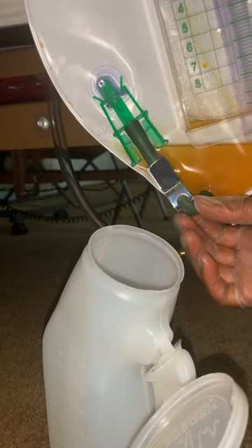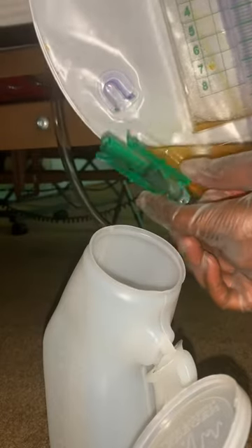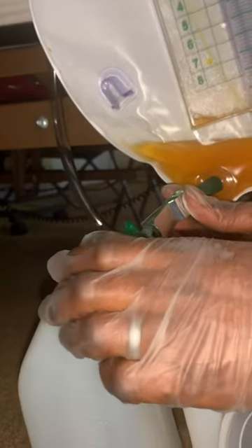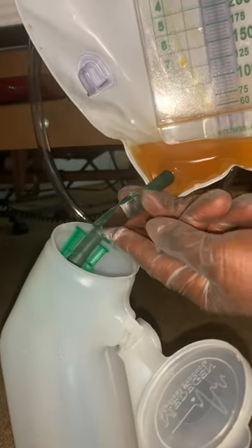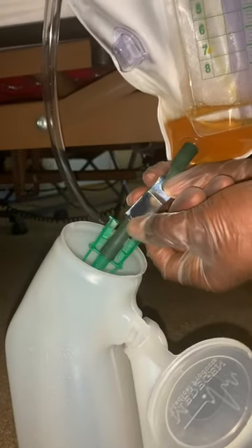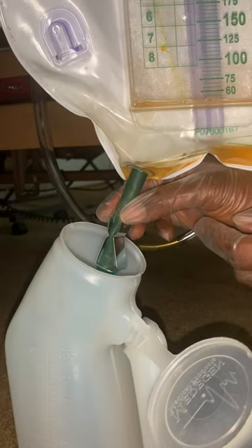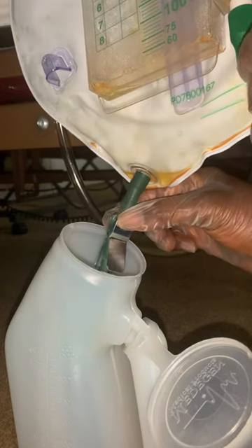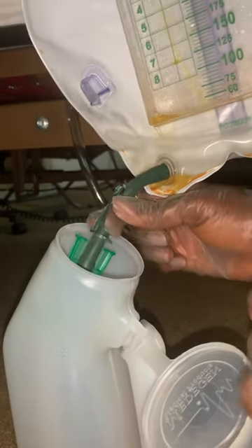This is just to show how to release the clip. First, take this out, pinch these two, slide it out, and put it in your container. Now this clamp right there is what you're going to release. It may be a little tricky — you need two hands. Once you release that, you can see it came out and all the urine is going to pour out into the container.